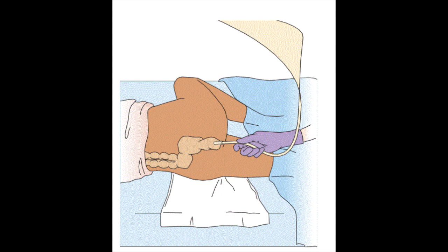Once you position your patient, apply clean gloves and place a waterproof pad under the hips and buttocks. While doing this, expose only the rectal area. Next, separate the buttocks and examine the perianal region for abnormalities such as hemorrhoids, anal fissures, or rectal prolapse. You want to do this because prolapse especially contraindicates the enema.